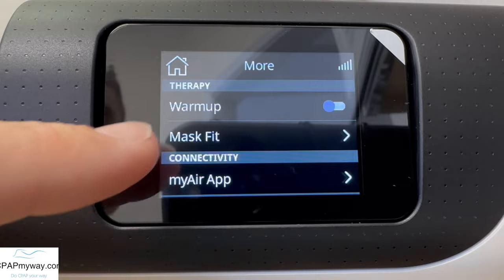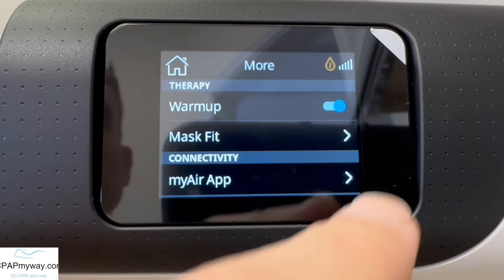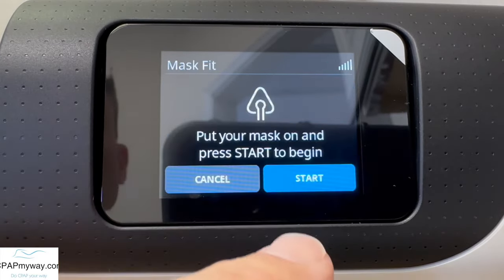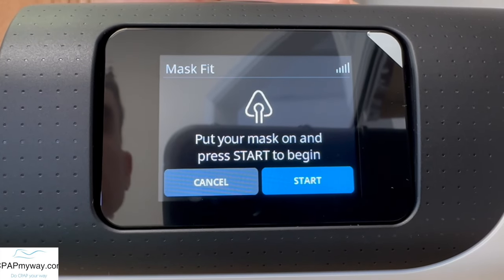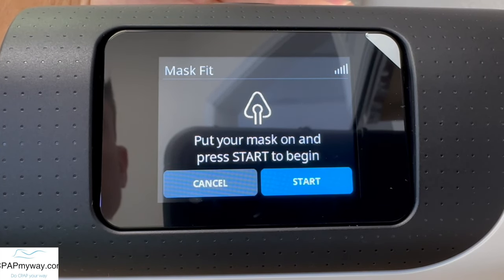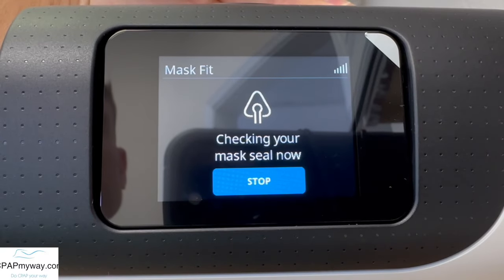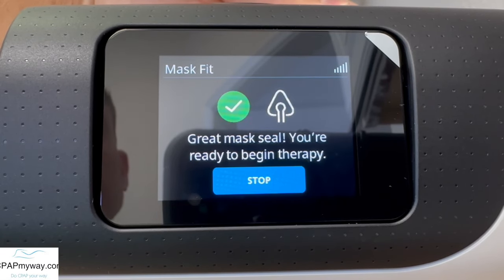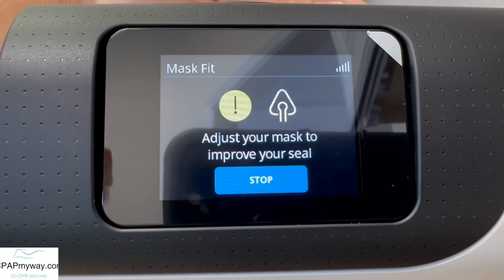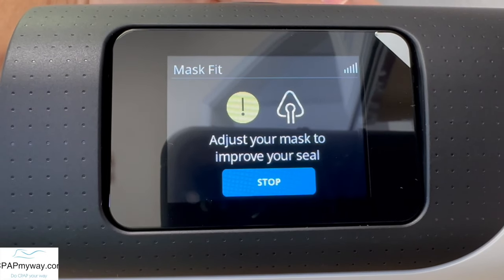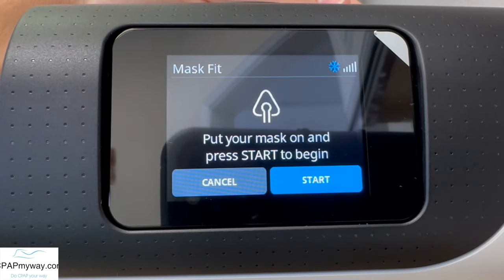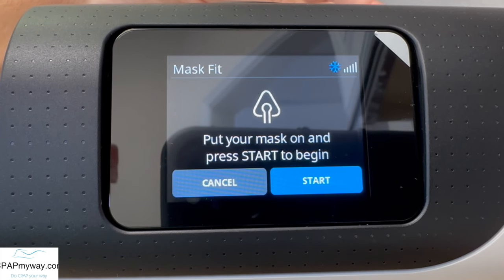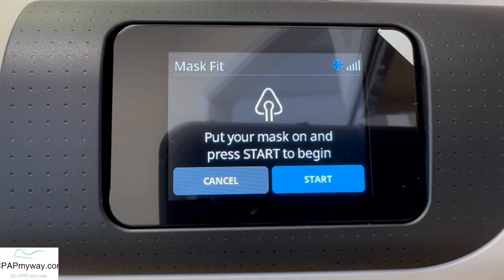If you click on more, you'll see a warm-up that'll pre-heat your water for you if you like. You see mask fit, where you can actually check your mask fit. Press start and it'll tell you how your mask is sealing. Obviously we don't have a mask on right now, but if you've got your mask on correctly, it'll give you a good or bad fit and you can adjust the mask.